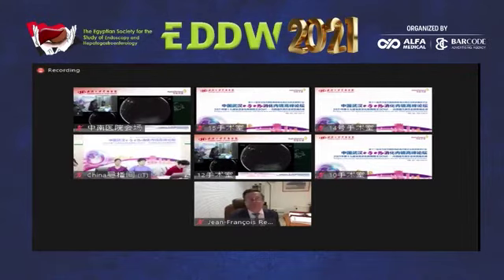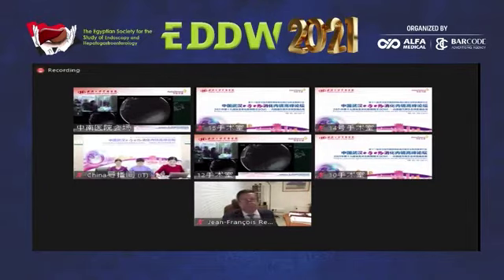Hello. You are ready here in Cairo. Dear friends in China. Yes, you can hear us, right? Yeah. What are you going to do? Dr. Jia will start artificial intelligence assisted upper gastrointestinal endoscopy. Okay.